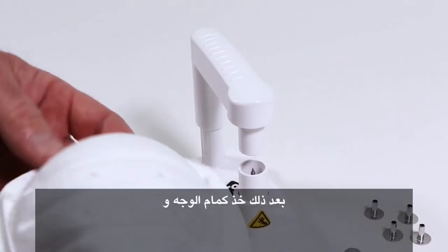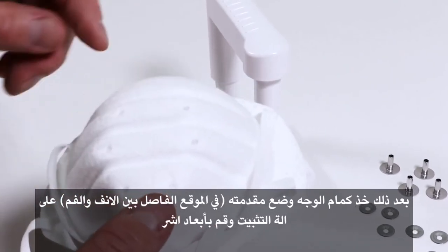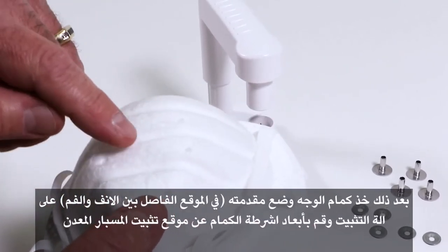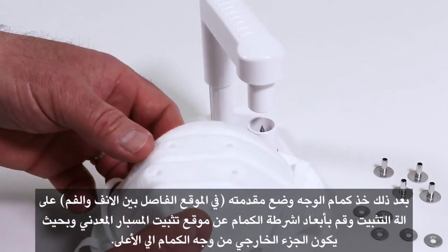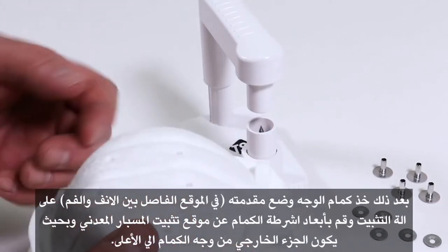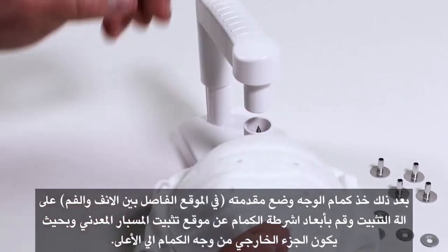Next, we're going to get our filtering facepiece respirator and make sure that the straps are out of the way. You want to make sure that you're placing the probe through between the nose and the mouth on the front of the filtering facepiece, and you always have the outside of the filtering facepiece in the up position.